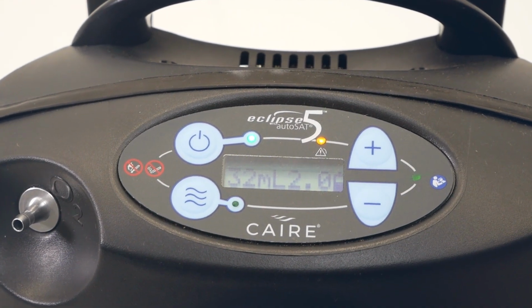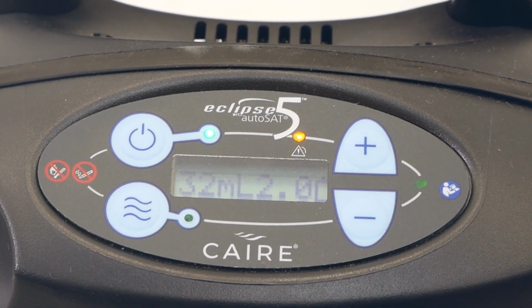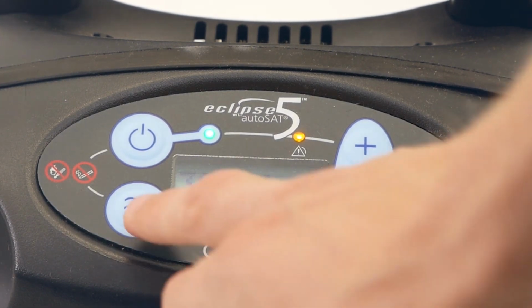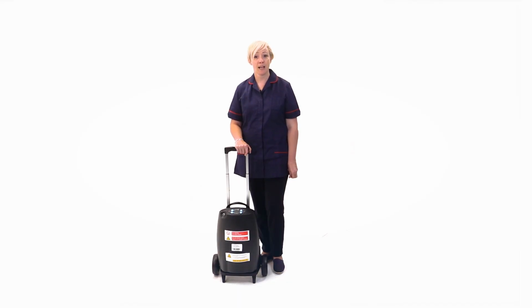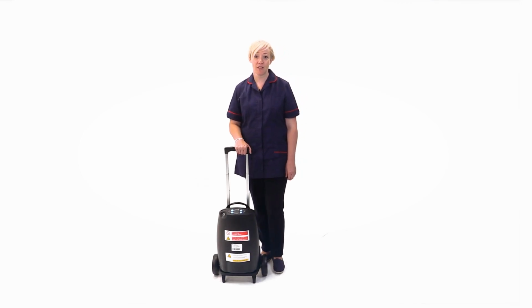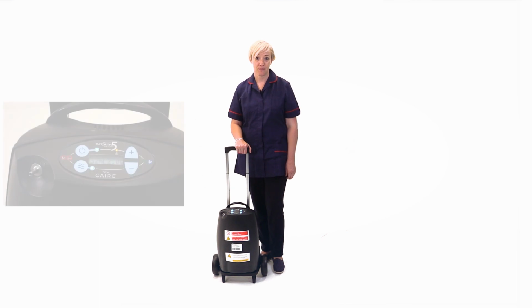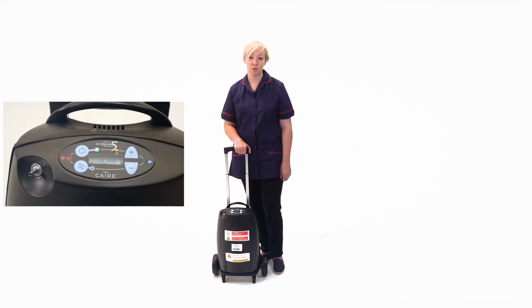If the device is illuminating a yellow alert indicator, this could be low oxygen concentration. This could be caused by a restriction in the humidifier, if you are using one, or in the tubing. If so, repair or replace the tubing or humidifier. The filter could be restricted, so ensure that it is cleaned. Or it could be that you are exceeding the maximum breath rate in pulse mode. If this is the case, switch to continuous flow mode until your respiratory rate resumes to an acceptable rate.